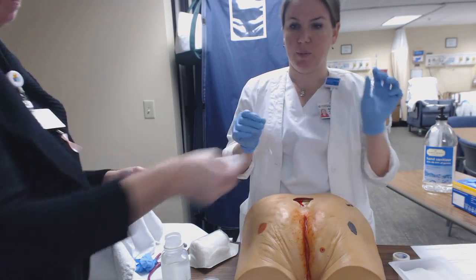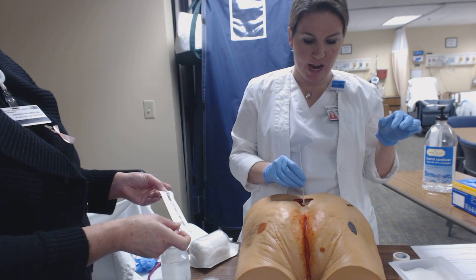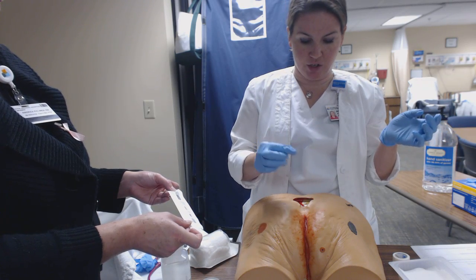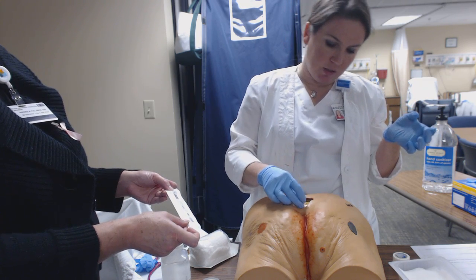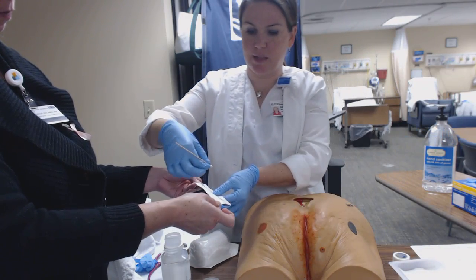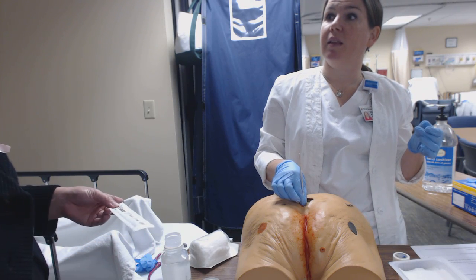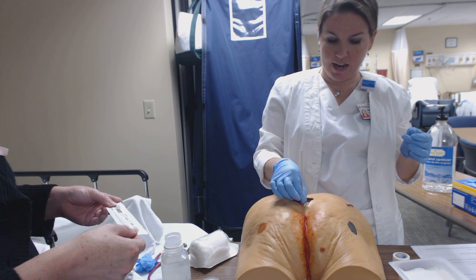So I'm going to get my cotton tip applicator, and I'm going to measure. We want to measure our depth of the wound, and it looks like this individual has the same amount of depth all around. So we can do that. Now you'll see some people measure this way, some people will measure this way. Right now we're just going to use the tip of the Q-tip. So I'm going to mark my spot here, can you see that? And then measure up against the package here. So it looks like it's at 1 centimeter. For our, what's this part called? I think that's the depth. Okay, so yes, that's the depth.